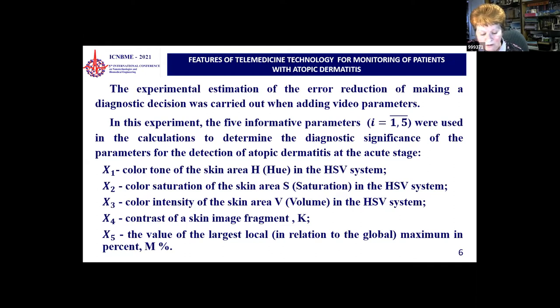X4, contrast of the fragment of the skin image, and the value of the largest local maximum in relation to the global maximum in percent. These indicators were measured according to the data of digital dermatoscopy using a handheld digital dermatoscope UM-039 camera with a 5 megapixel video sensor and 20-fold magnification.